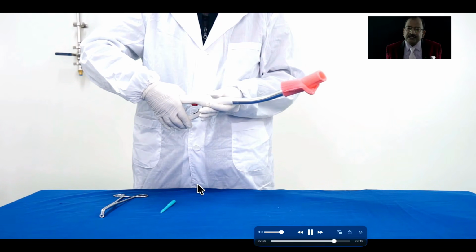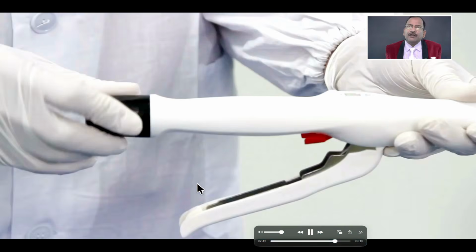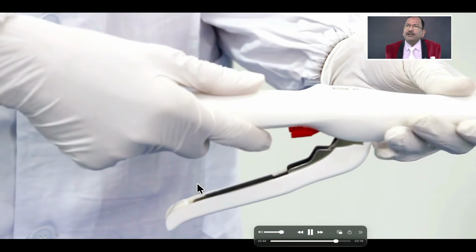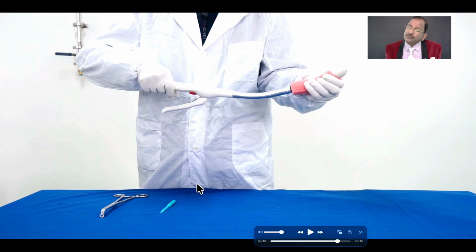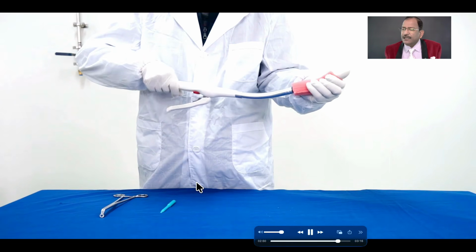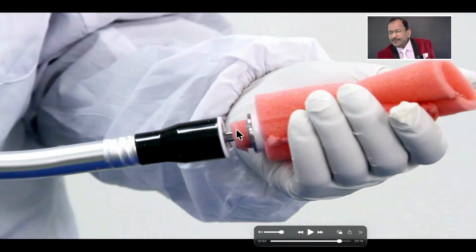And once it is done, now it will be rotated anti-clockwise. Once you rotate anti-clockwise, the anvil will go away from the gun, but it is not detached. Then both together, with up, down, right, left movements, a little bit, just like the PPH stapler, slowly the anvil and gun both come out together. And then you have 2 donuts.